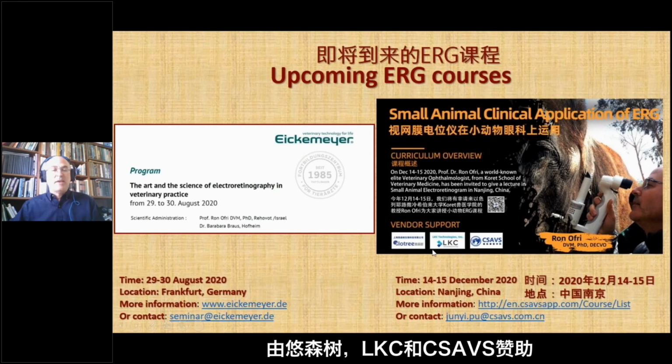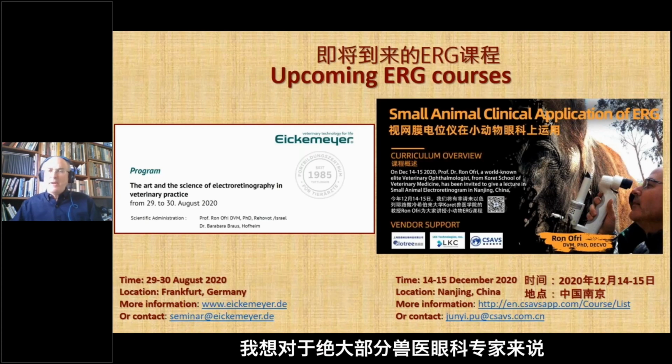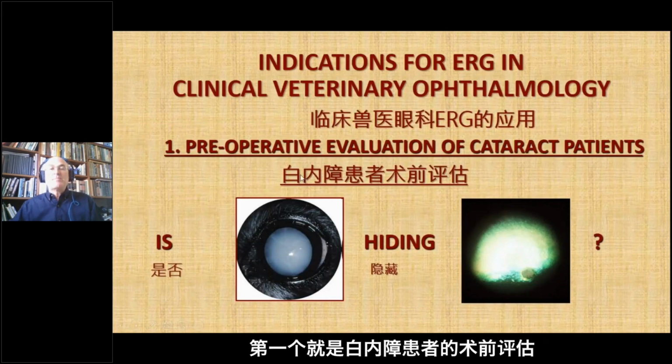and CSAVS. So as I said, I'm going to talk about why ERG is crucial to your veterinary ophthalmology practice. And I think it is fair to say that most veterinary ophthalmologists will record an ERG for one of two reasons. The first one is preoperative screening or evaluation of cataract patients.